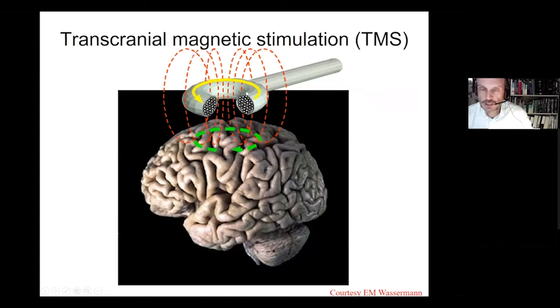Yes. Good. So TMS consists of a so-called coil. The coil has a high impulse, which generates by the electromagnetic induction theory a magnetic field, which penetrates within the skull and elicits another electric current, an electric field actually, which involves the superficial layers of the cortex.